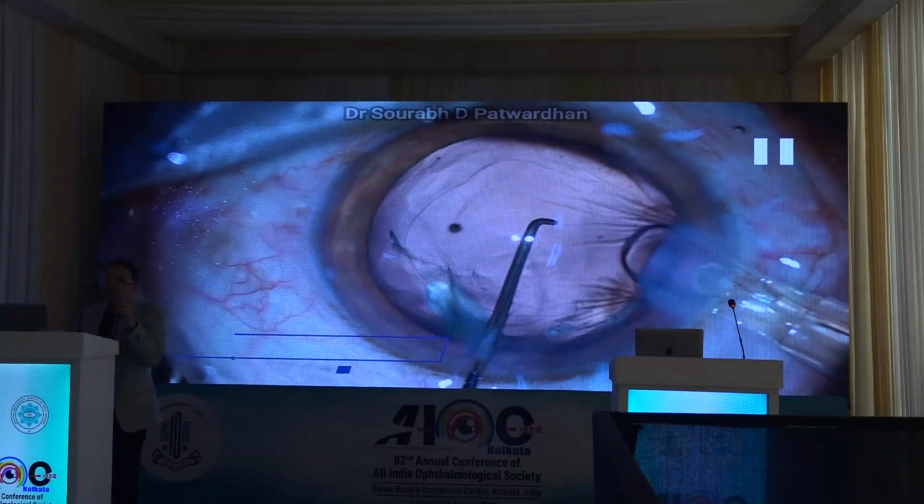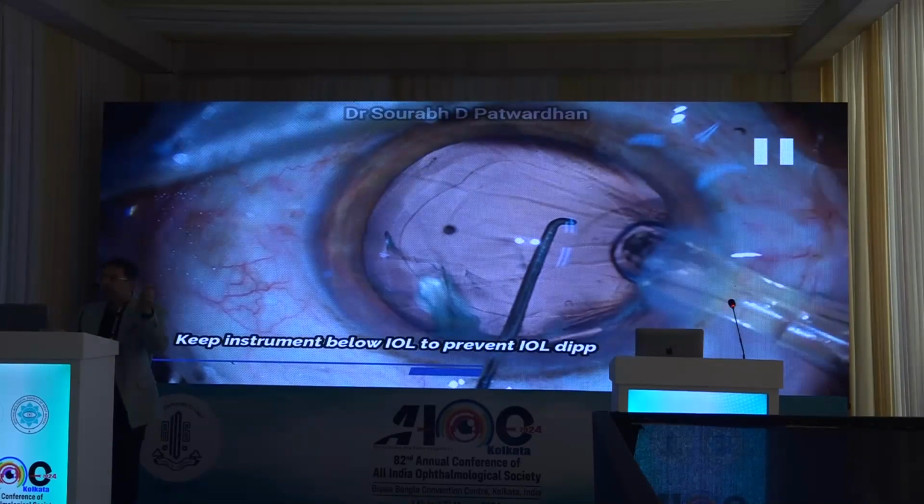Now, second thing, what I did just now is I enlarged the incision slightly, because after vitrectomy the eye is a little hypotonous and you don't want to struggle putting in your injector. So slightly enlarge the incision so your injector can easily go in.